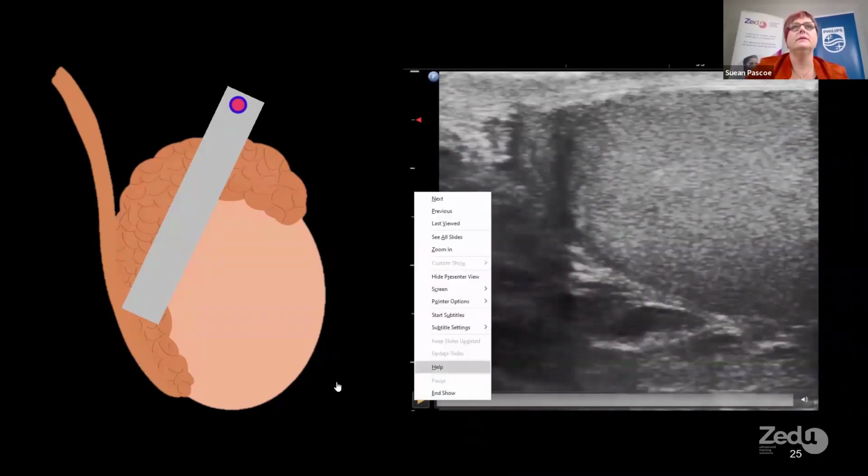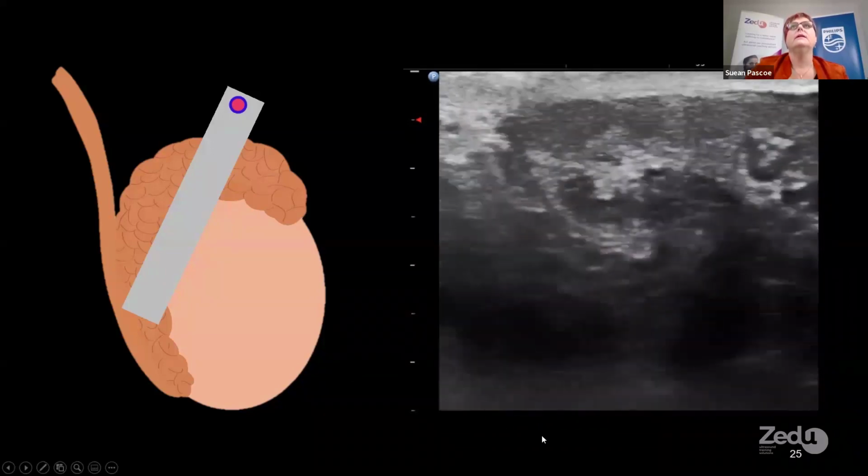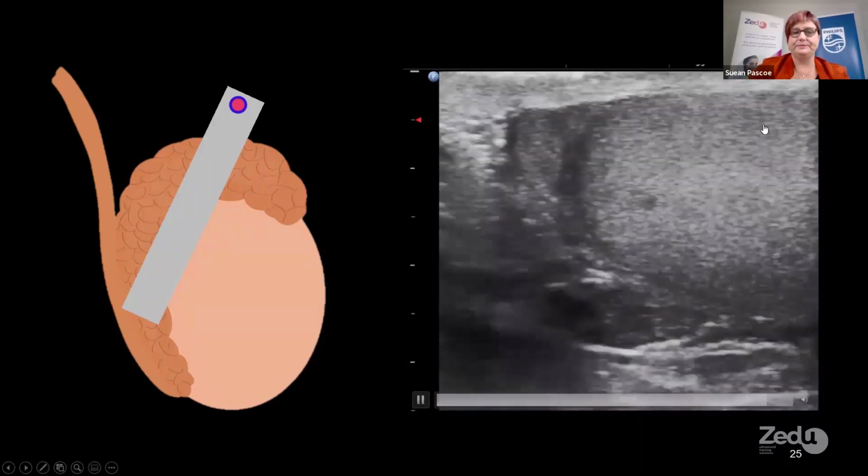I'll just play that again. As we come out, you can see that band of hypoechoic tissue here.